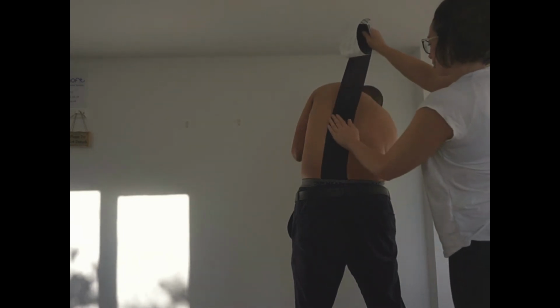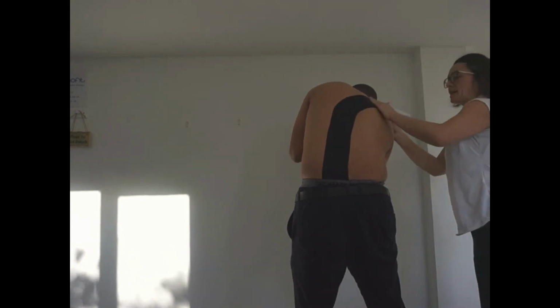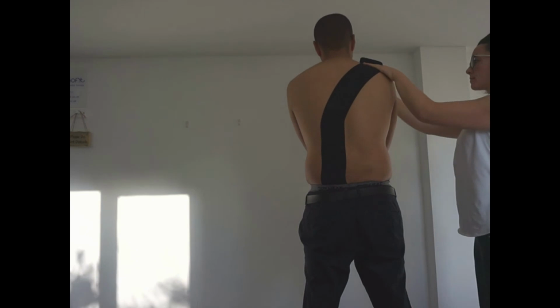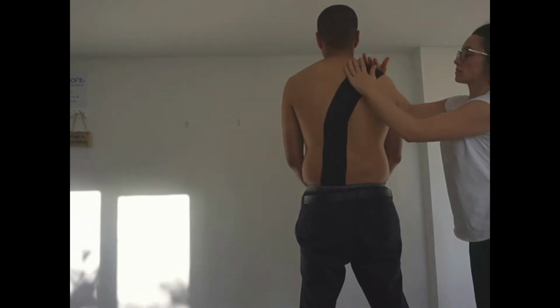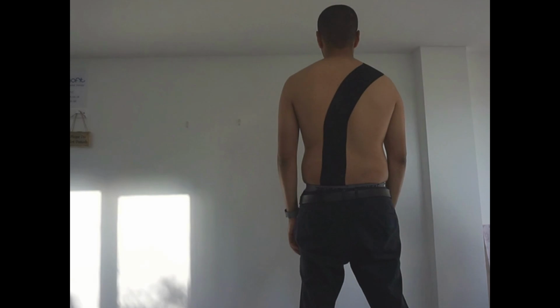And now my client is stretching that right shoulder away, putting it on stretch, so that I can then add a medium stretch to the tape and lay it down on the stretched target tissue. Get my client to relax and anchor in front of the chest with no tension. So now that black line is mimicking that green line, creating a constant recoil back towards a neutral position.